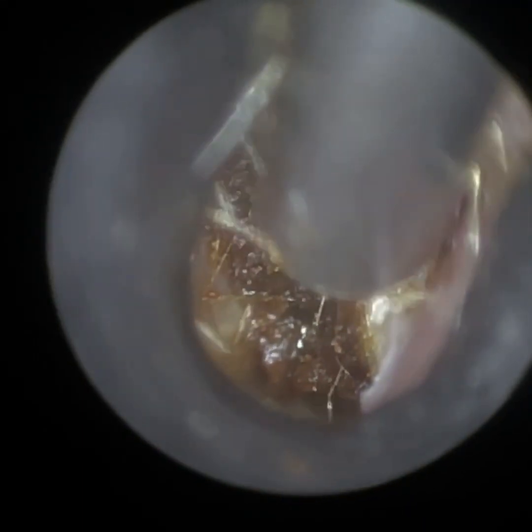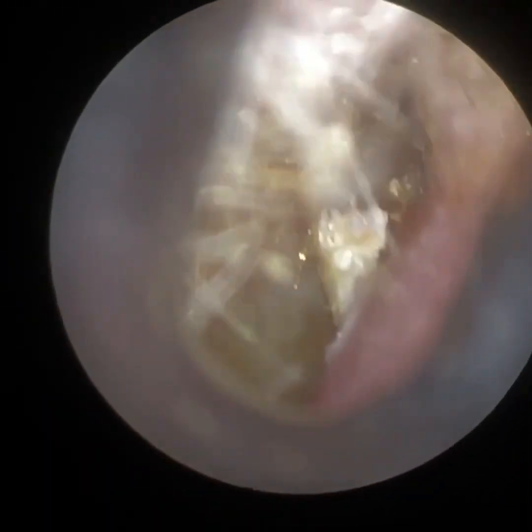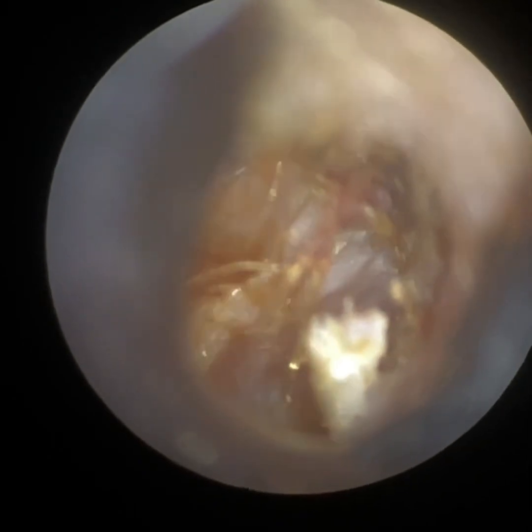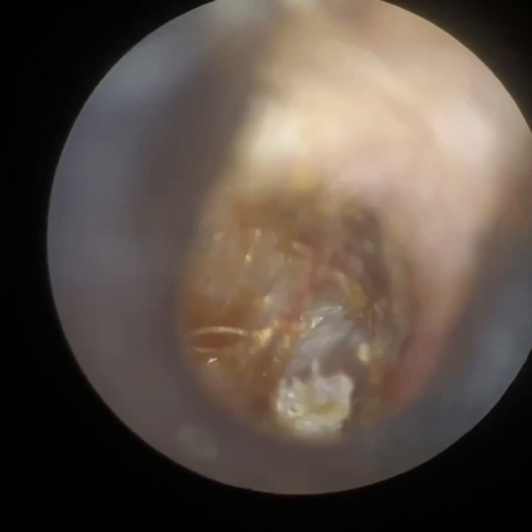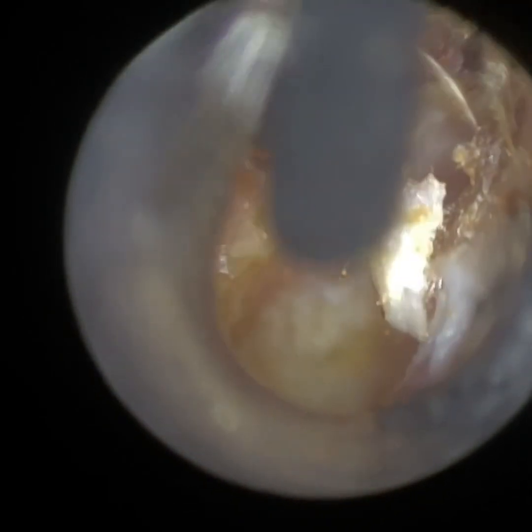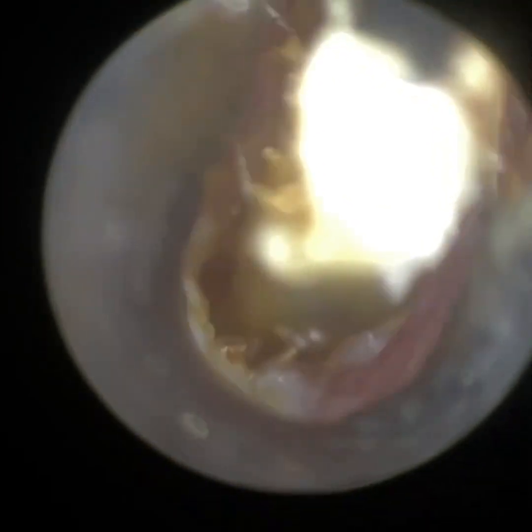So it's just one more thin layer of wax and keratin on the eardrum. That's the patient's eardrum there — it is slightly retracted, but you can't really see the typical landmarks. There's a bit of keratin superior on the roof — I'm going to get that with a fine end. It's a very hard eardrum to visualise the landmarks. You'll get a perspective when I go back in with the endoscope. The endoscope is in a league of its own, but admittedly it's a lot more difficult to train people and acquire the skills necessary, because it requires a lot of bilateral integration — using both hands in conjunction with one another: one hand with the endoscope, one hand with the instrument.